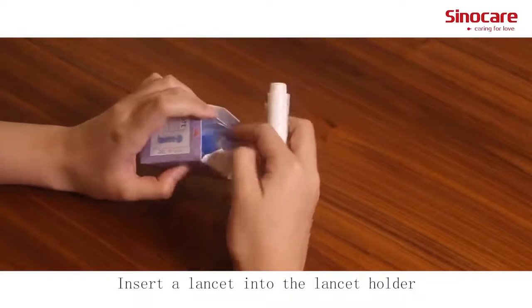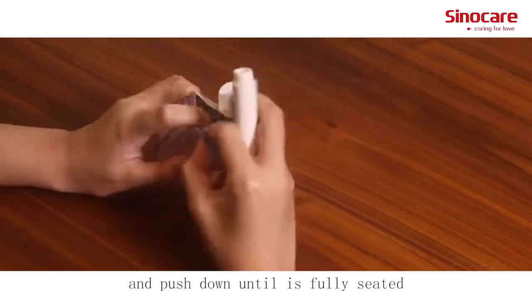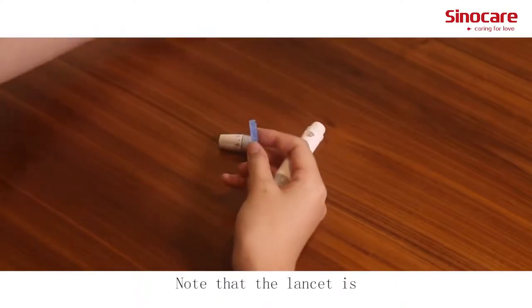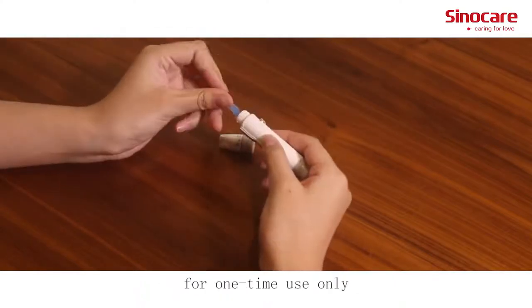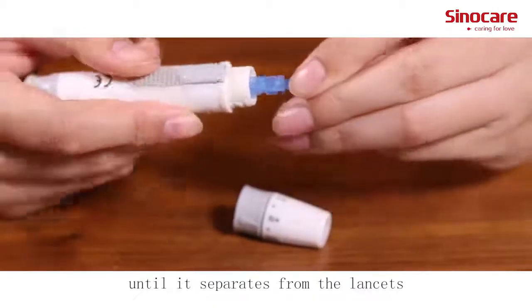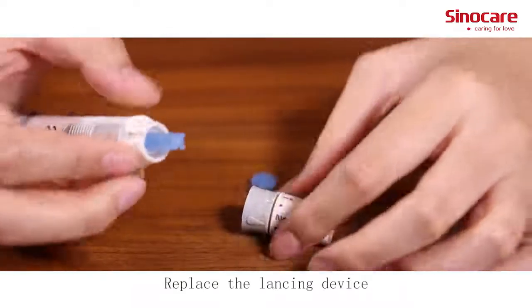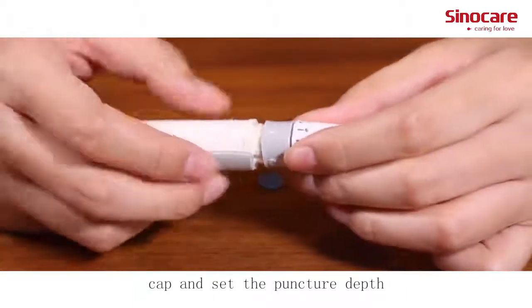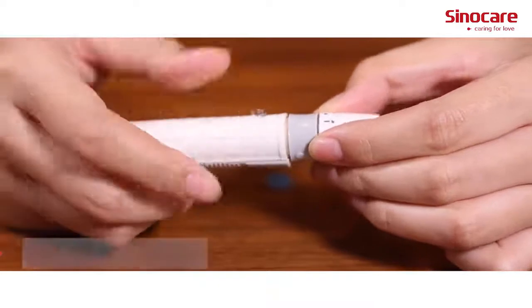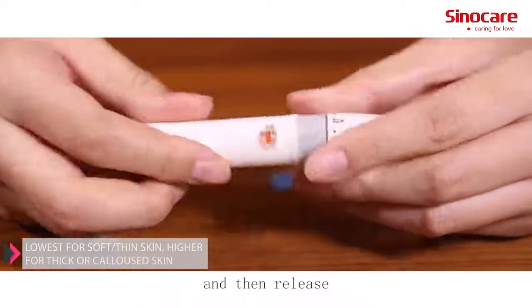Insert a lancet into the lancet holder and push down until it's fully seated. Note that the lancet is for one-time use only. Twist off the protective cap until it separates from the lancet. Replace the lancing device cap and set the puncture depth to the desired number. Pull back the cocking control until it makes a click, then release.